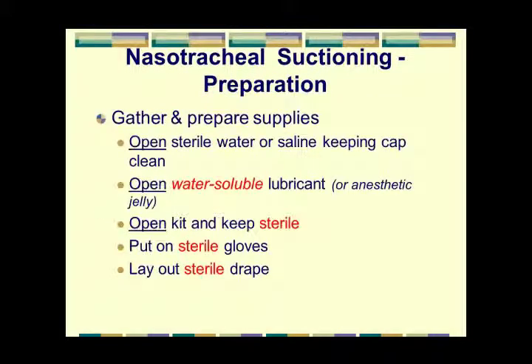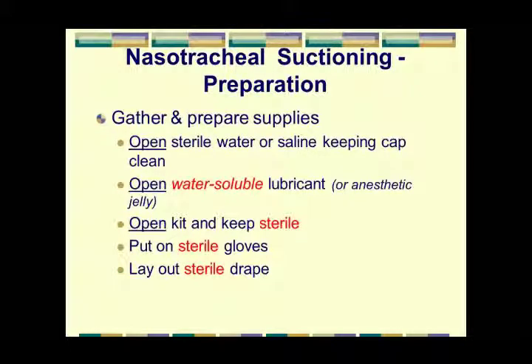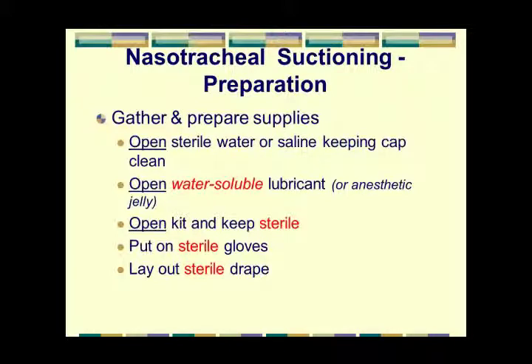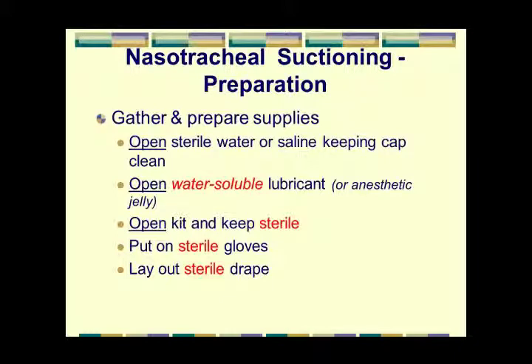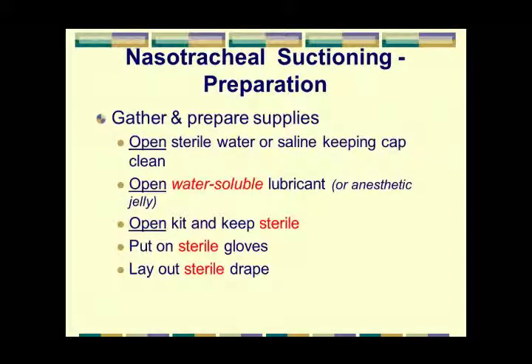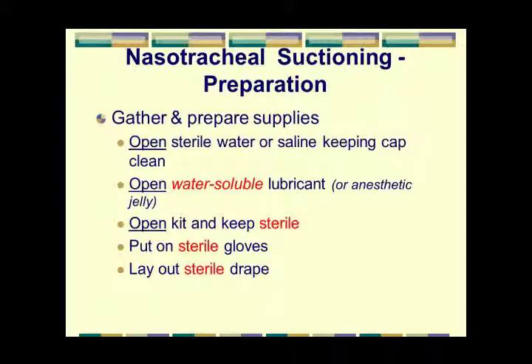Okay. Now we need to go ahead and get our supplies. We're going to open our sterile water, keeping the cap in a sterile fashion. What does that mean? I don't unscrew the cap and put it open end down. I put it closed end down, so I'm maintaining sterility. I open water-soluble lubricant if I need to. Again, it's going to be in a sterile fashion.